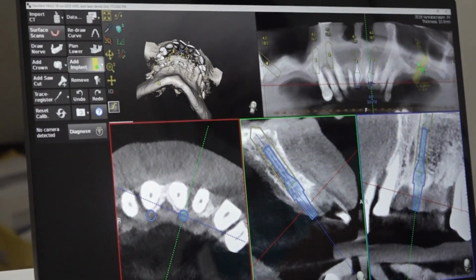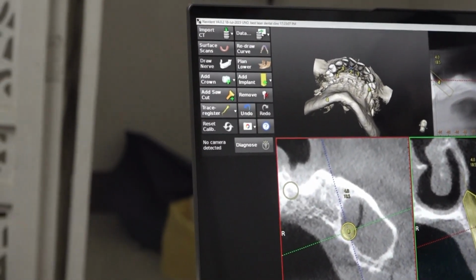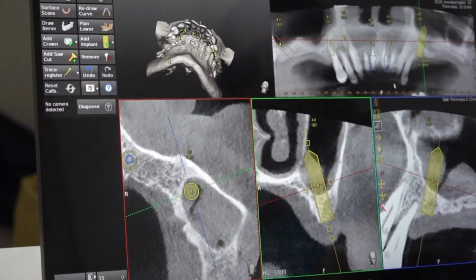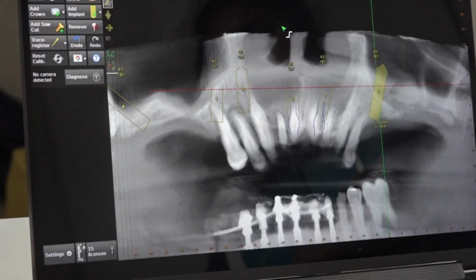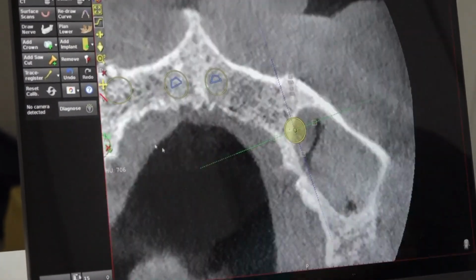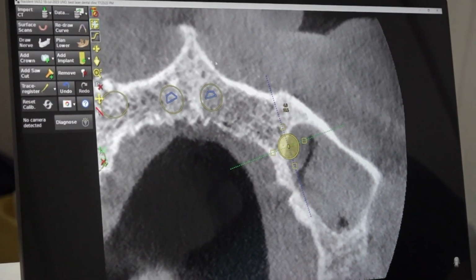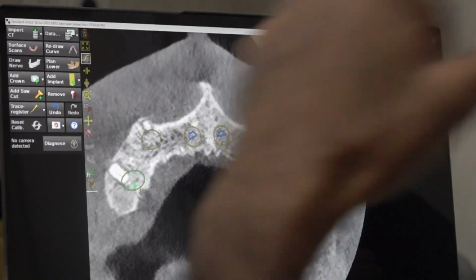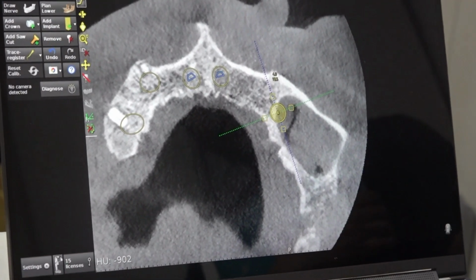Now we will place one implant at the second premolar, which is missing. Unfortunately here the bone is less. See, in the panoramic view I have placed the implant in the second premolar. But if you see here, it is partly in the sinus. That means the sinus has invaded the second premolar area. Compared to the right side, on the left side the sinus is expanded anteriorly.